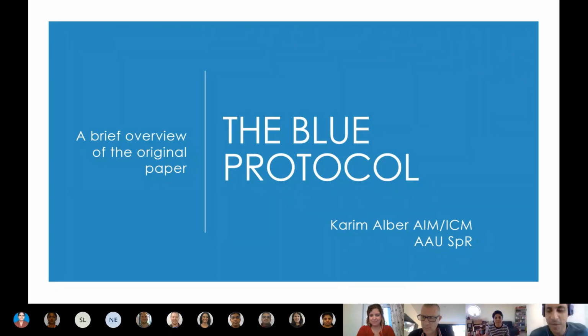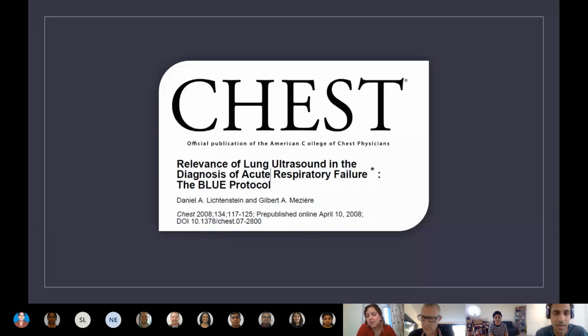Thanks, Priya. Hi, everyone. So I thought we would kickstart the session today by reviewing one of the seminal papers about lung ultrasound. We'll leave it in Microsoft Teams to have a look at later if you want. It was published in Chest in 2008, titled Relevance of Lung Ultrasound in the Diagnosis of Acute Respiratory Failure, the Blue Protocol. And Blue stands for Bedside Lung Ultrasound in Emergency.